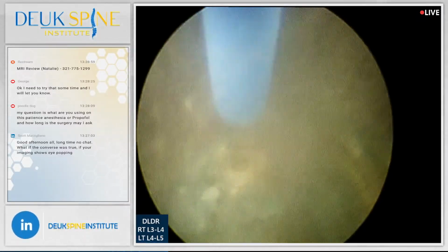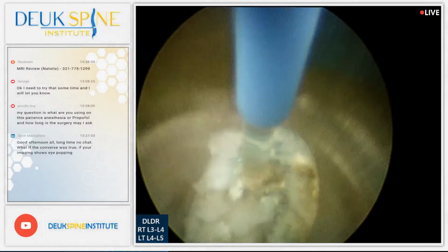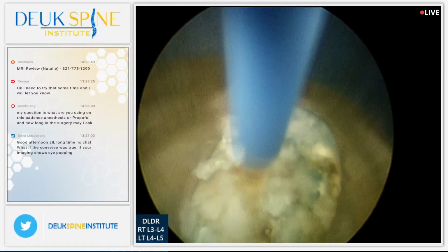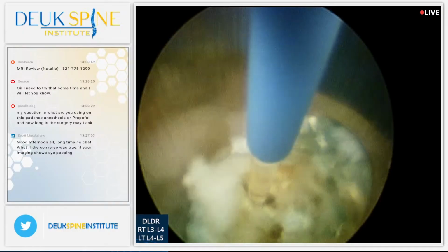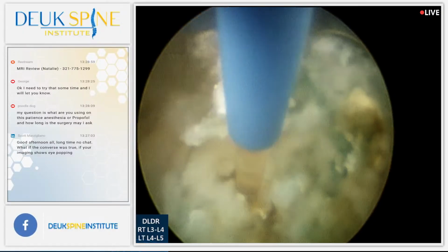And I did the same thing in the neck when I was doing cervical disc. Basically, long story short, it turns out the laser's essential for getting rid of back pain and essential for getting rid of neck pain from the disc when you have discogenic back or neck pain.